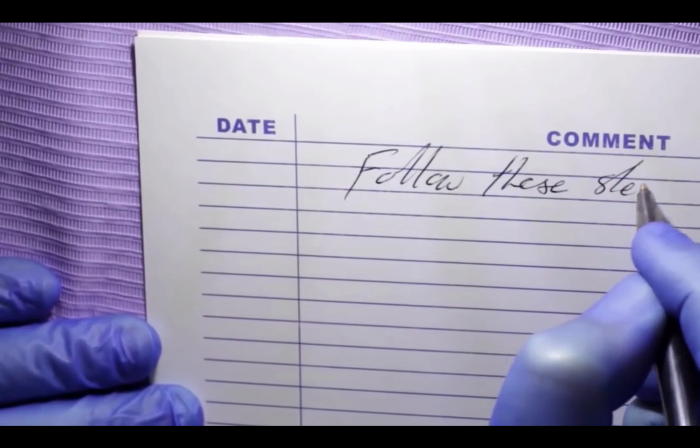Follow these steps to perform the modified Allen test. With the middle 2 or 3 fingers, not the thumb, locate the pulsing radial and the ulnar arteries of the palm side of the wrist. See illustration. Keep in mind that the ulnar artery is smaller and more difficult to locate. Ask the patient to make a tight clenching fist for about 30 seconds. Apply firm pressure over the ulnar and the radial arteries, occluding both of them.